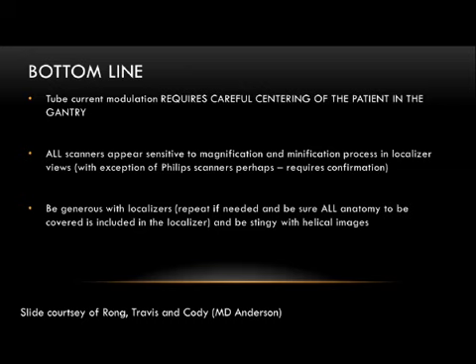Now, one of the challenges is, all right, I'm doing a chest, abdomen, pelvis. Where do I center the patient? You could have a barrel-chested patient or a pot-bellied patient, and you're centering for those two. You could center in the chest on the barrel-chested patient, and then all of a sudden the abdomen is well below isocenter. And for the larger abdomen patient, you could center on the abdomen, and then your chest is well below isocenter.